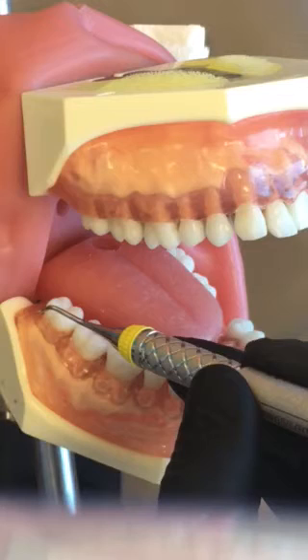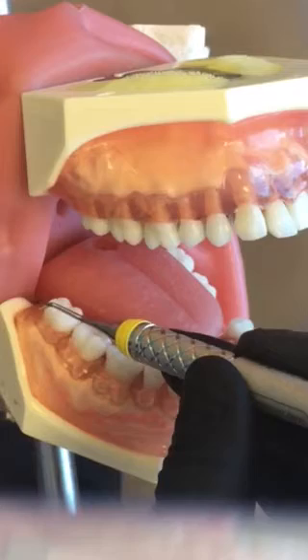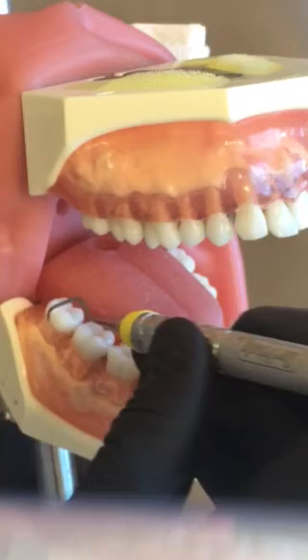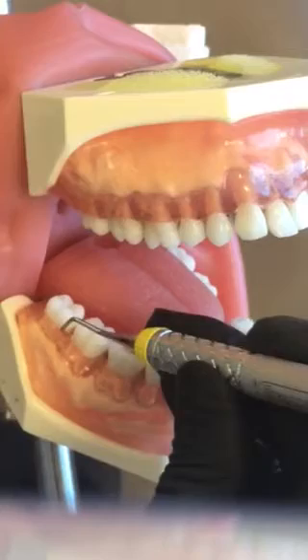You're going to start at the distal line angle, leaning the curette towards the tooth just a little to establish your 70-degree angulation. Your new distal line angle in a round, remove the curette from the sulcus, and then lead with your curette starting at the distal line angle, then oblique strokes across the buccal, and around the mesial.